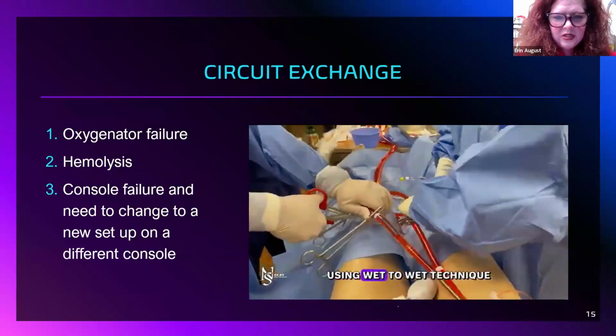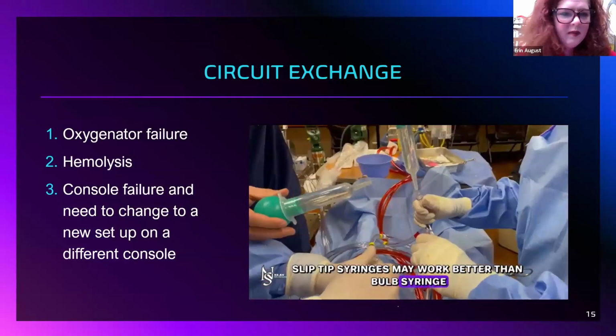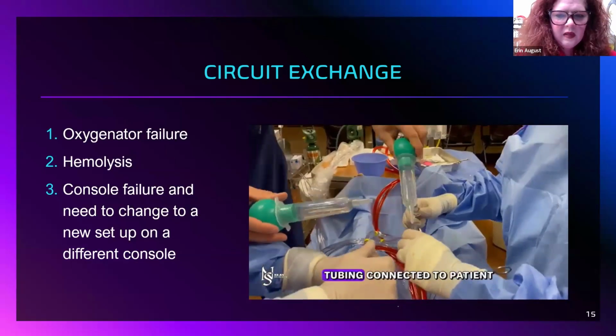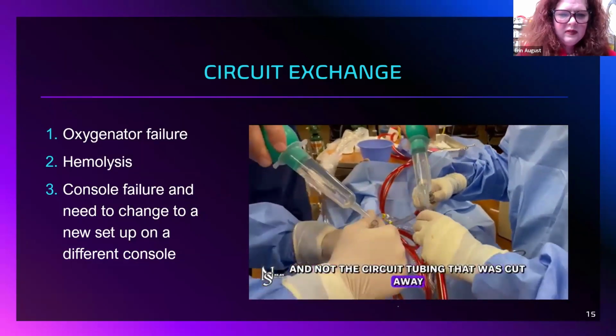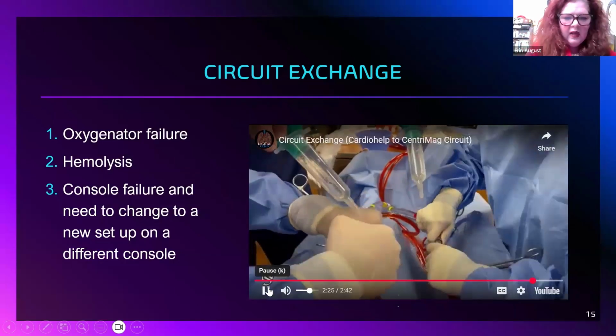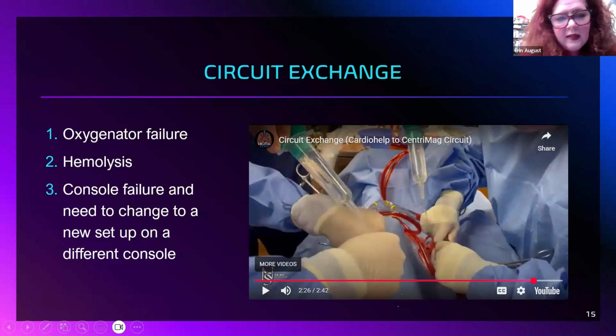Decreasing the downtime of the patient. And here again, all about technique. We know this right here. This is something that I would have my team practice over and over again. I even gave them a piece of tubing with a 3/8 connector on the end and had them take it home along with two clamps.